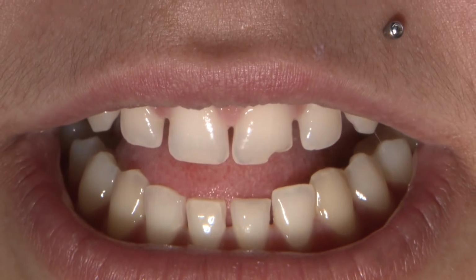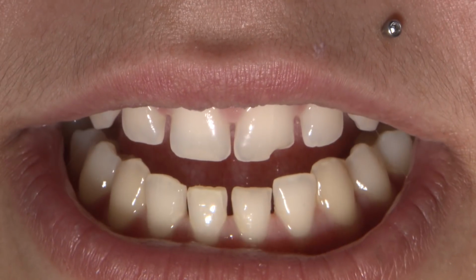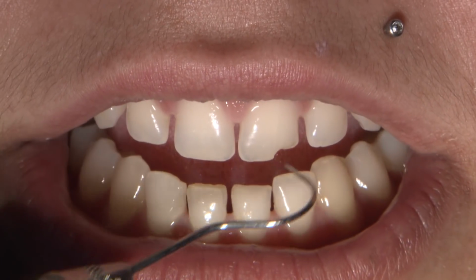Dr. Muresan is going to change the gingival height using a series of gingivectomy procedures over time and allowing them to heal. Well, let's see how this works. Let's check it out. Dr. Muresan? Welcome back. Let's dive right in where we left off from the last episode and continue with the treatment.